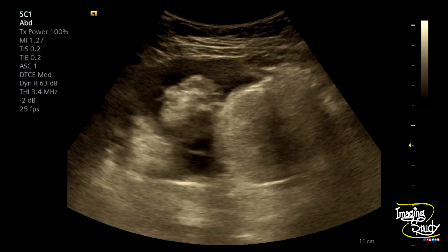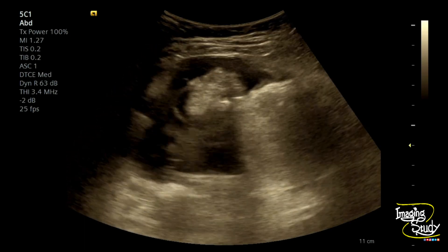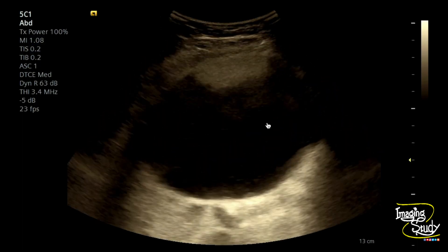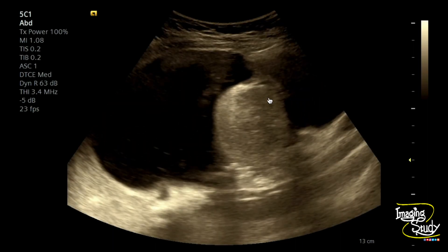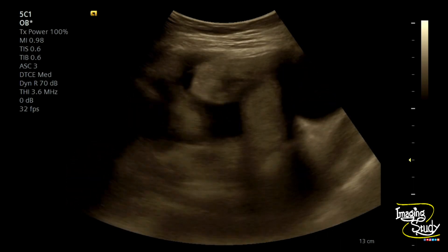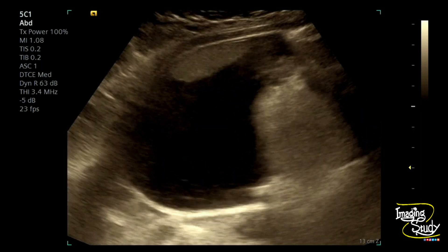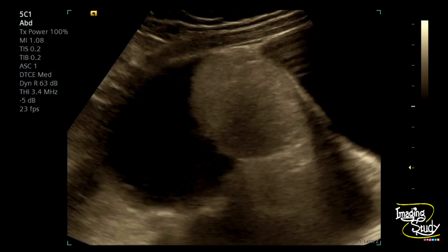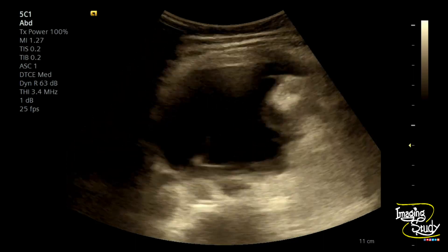When we jump into the left adnexal region, you can see a large mass containing cystic and solid parts. These solid parts are quite different from those seen in a malignant lesion — they are round, echogenic, and sound-attenuating. The proximal part from the transducer surface looks brighter than the distal part, indicating sound attenuation, which is a common feature of fatty tissue. These multiple round to oval diffusely echogenic sound-attenuating masses are fat balls floating within the cyst cavity, forming the floating ball sign.